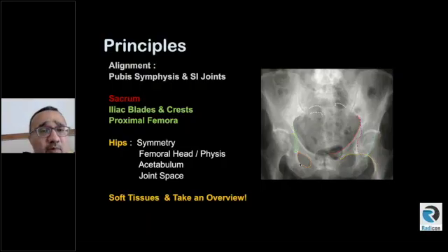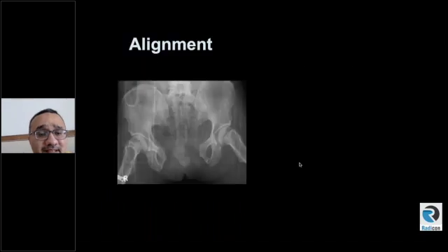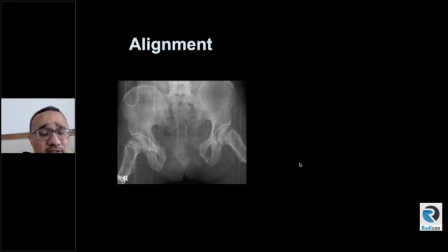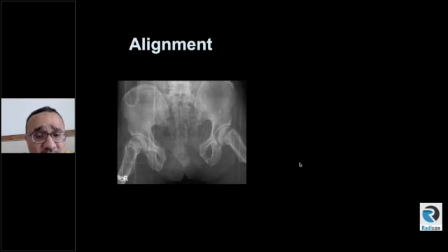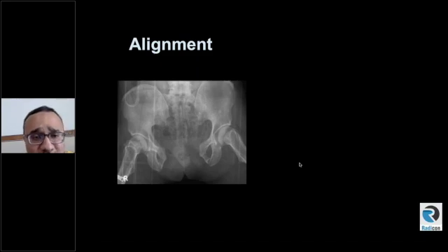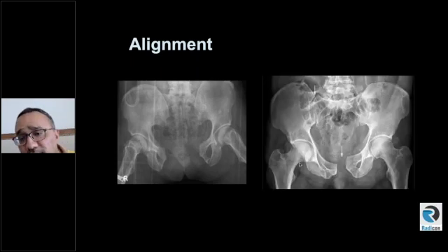So now we're going to go through these things one by one. That's an obvious abnormal plain radiograph showing an open book pelvic fracture, AP compression type, but it's unlikely in the exam that they're going to show you this kind of film. The reason I've put this on is just to demonstrate there is marked widening of the pubic symphysis.